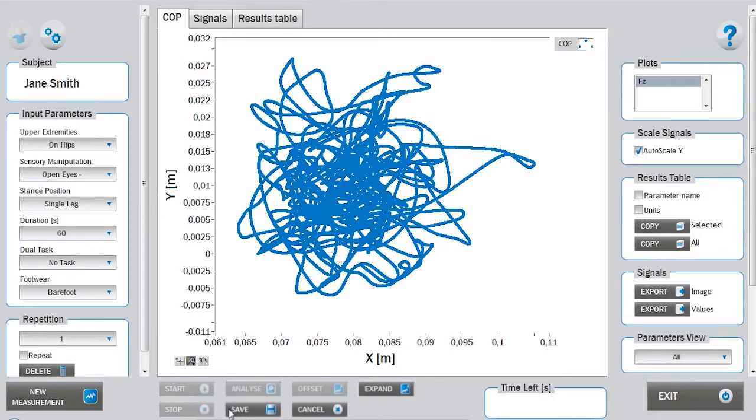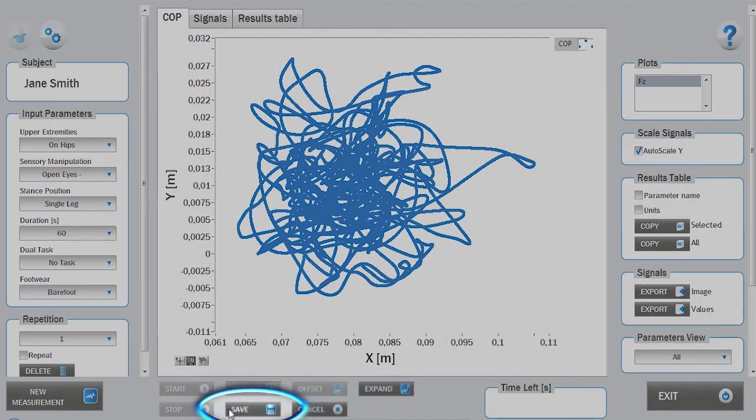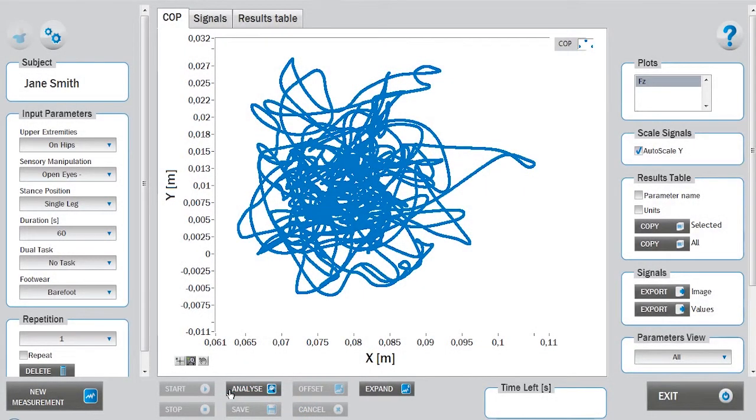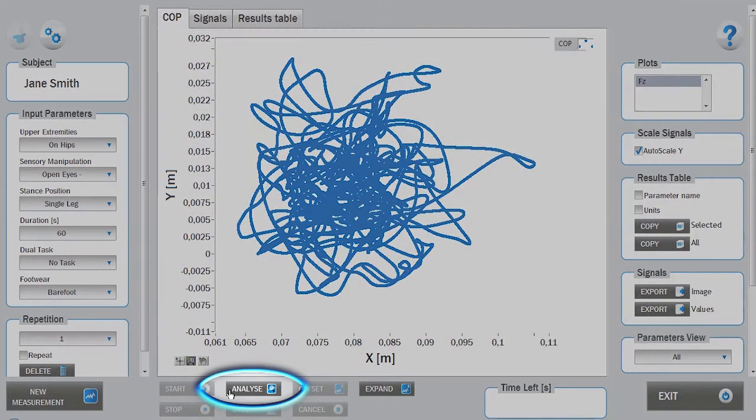If you are satisfied with the measurement, you can save it. The central window displays the center of pressure measured by the force plate. If the settings for the analysis were changed after the measurement was completed, you can reanalyze the data by clicking on analyze.